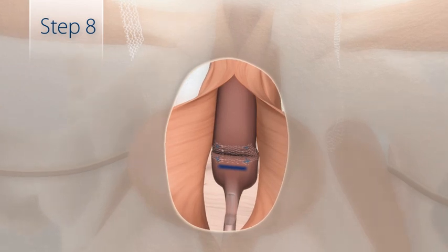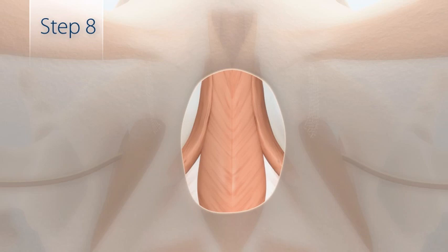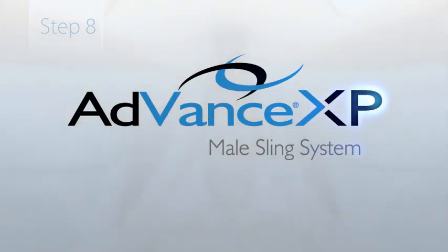Once sheaths have been removed, confirm sling tension. The procedure is completed by closing the bulbospongiosus muscle, the rest of the perineal incision, and the stab incisions.